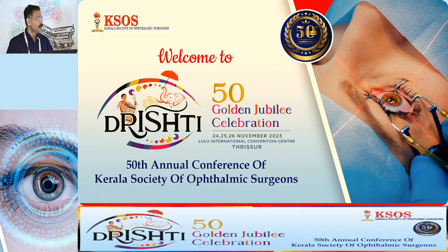And especially in a good looking, healthy looking cornea. But if it is already a large flap, 2-3 millimeters, I would suggest better not to manipulate it, because we cannot keep on looking at it. We say you have one eye on this, one eye on that, nothing like that. You will be looking only at the phaco tip. Otherwise, you have to change your view and look at this and stop phaco. It's not possible. So if it is a large, vague looking one, better abandon and make an incision next to it.